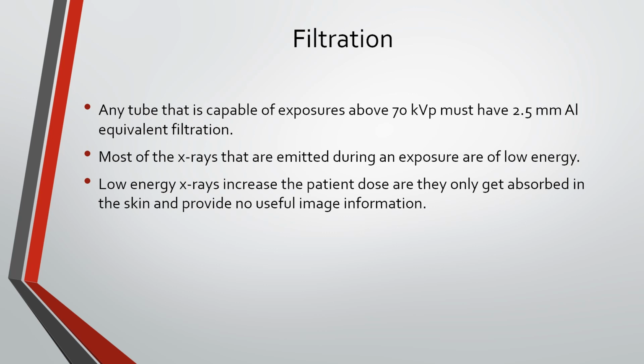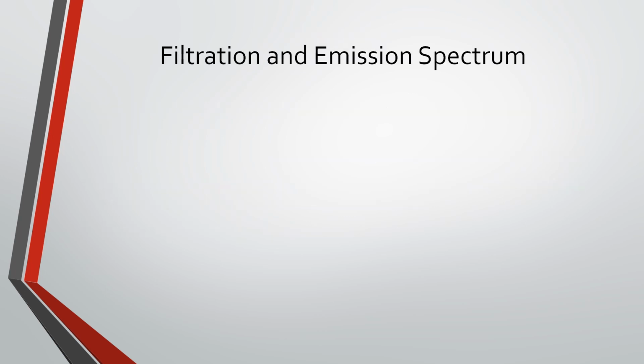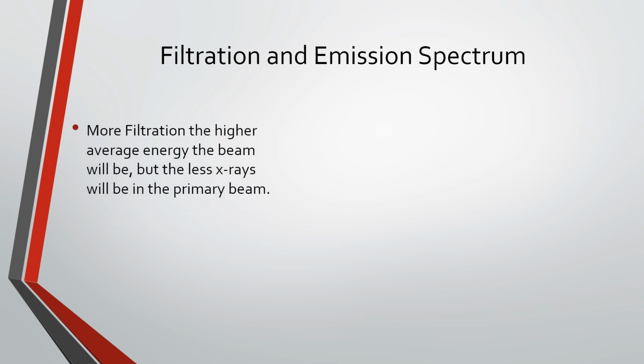Low energy X-rays increase the patient dose, and they only get absorbed in the skin and provide no useful image information. All these low energy X-rays that are produced. And most of the X-rays that are emitted during exposure are low energy, as we just said. This is why filtration is employed, to filter out these low energy waves that add no useful information to the image.